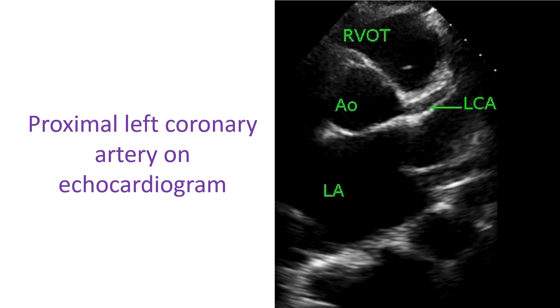In some patients with renal failure, the images are good enough so that the left anterior descending coronary artery can be imaged to a long extent. Probably the waterlogged thorax permits better transmission of ultrasound in these cases.